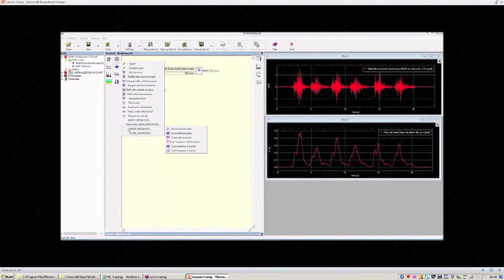And then if we want to express the value in 100%, we can multiply the results by 100.